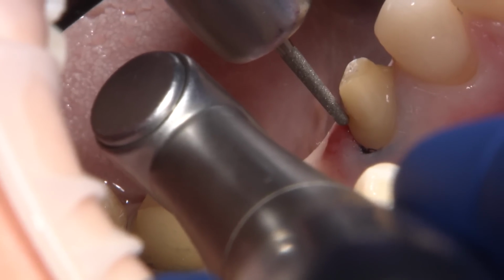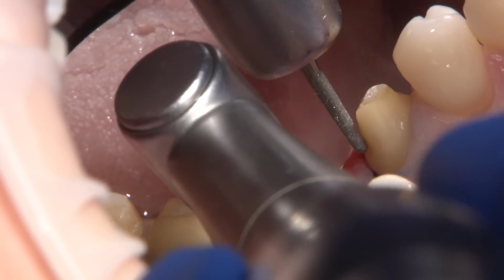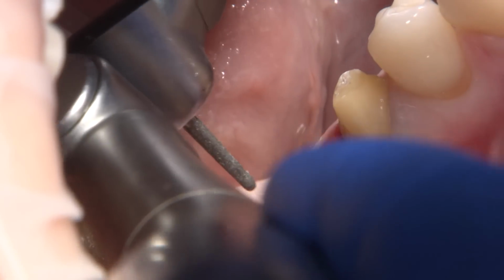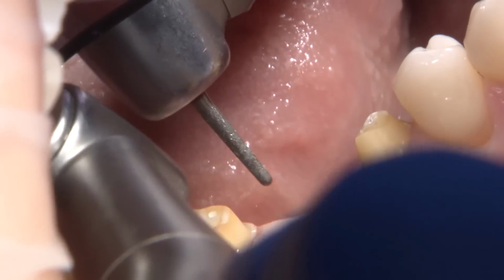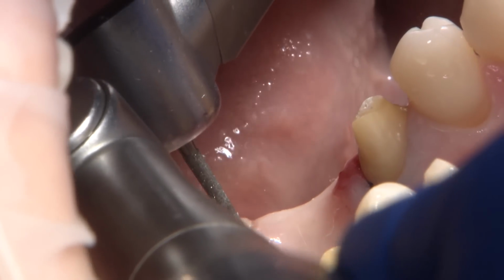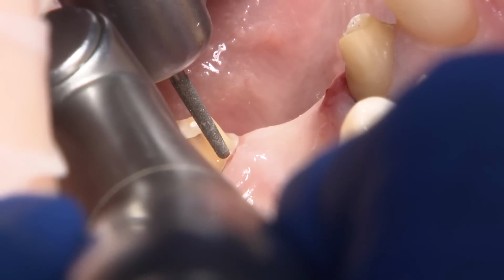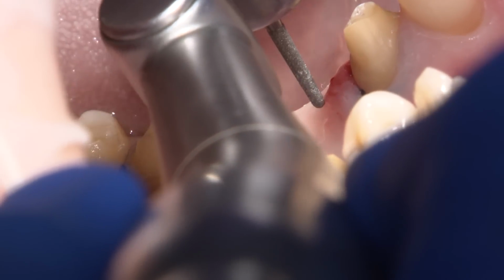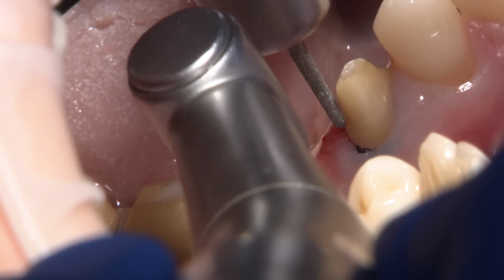While I have direct visibility from my side, I can put the bur against one prep and, using my hand-eye coordination, freely move the handpiece, eyeballing the preparation walls and the insertion axis. With this method, I can check if the abutment axis will provide a common path of placement. The mirror helps me view the inter-abutment convergence from the opposite side, in the end minimizing the undercuts.